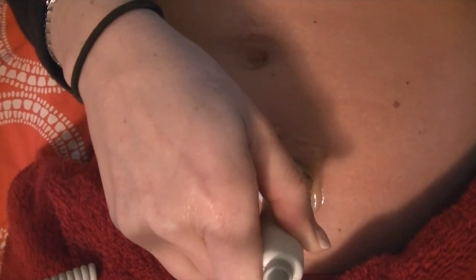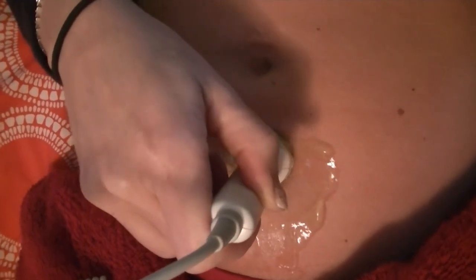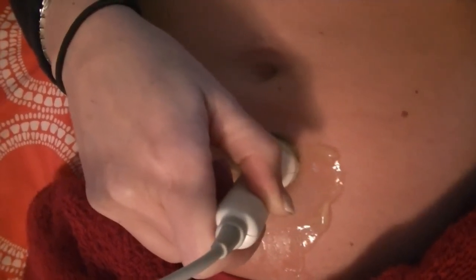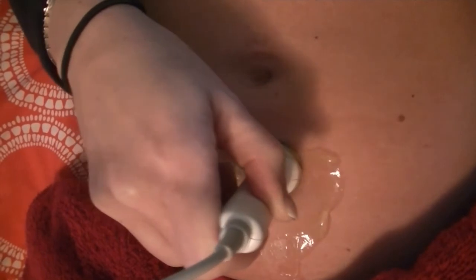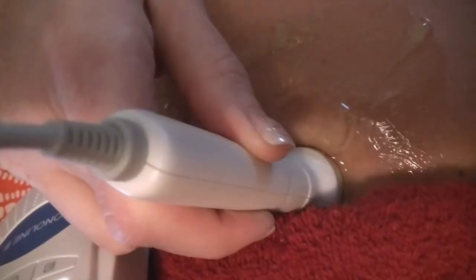That's not the baby's heartbeat. That's mom's heartbeat, or my heartbeat right here. So do you hear the difference? My heartbeat, maybe placenta, not really sure. That's definitely baby's heartbeat.